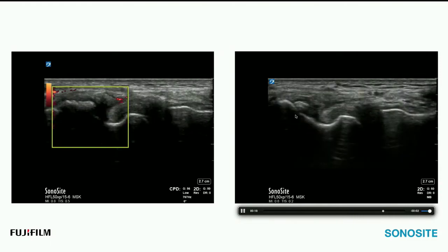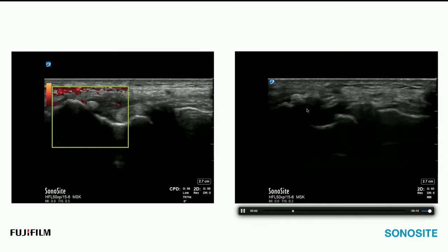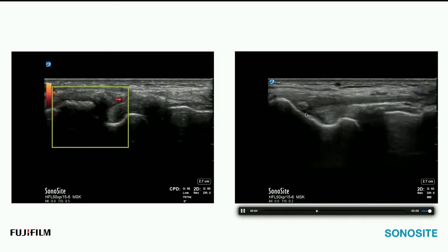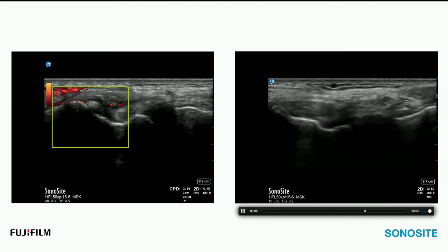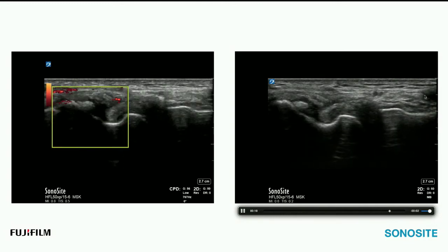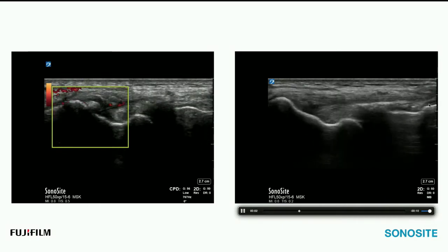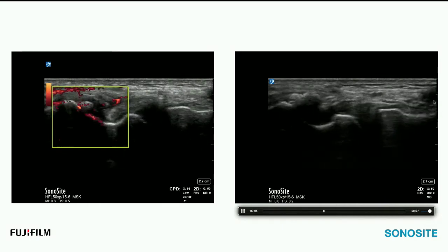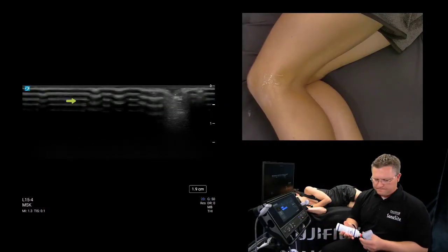So looking into your clinical toolbox, using all the tools you can, ultrasound is a great one to decide, hey, could you chase down a calcium deposit early and get it out of there. Far right side of the screen, scanning live, you can see that biceps femoris creeping its way over the LCL just as a pitfall. It's normal, and we'll check that out in the live demo. As promised, we'll be moving back and forth between live demo and presentation. So I'll go ahead and get moving on that.